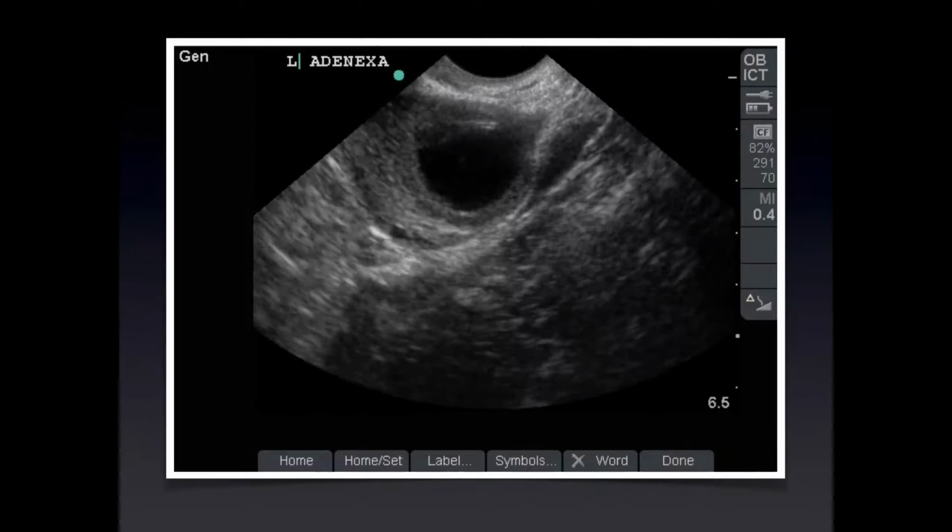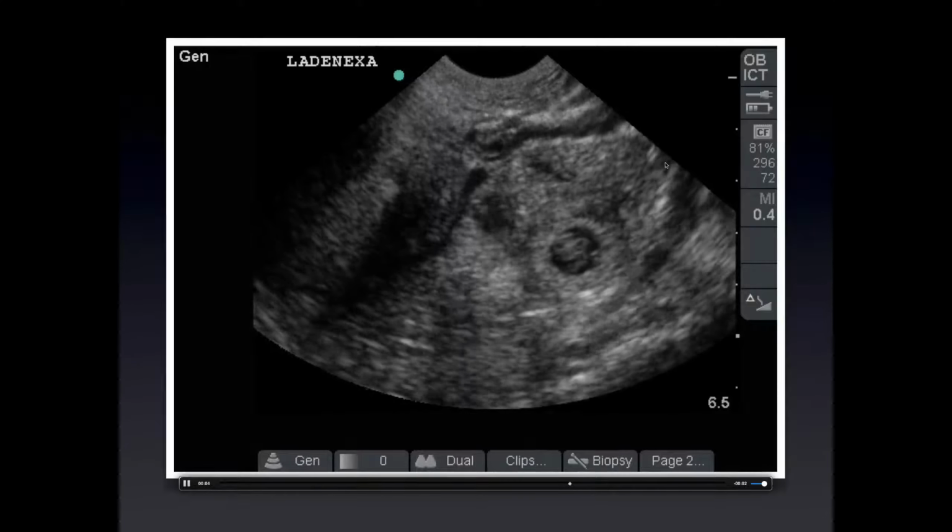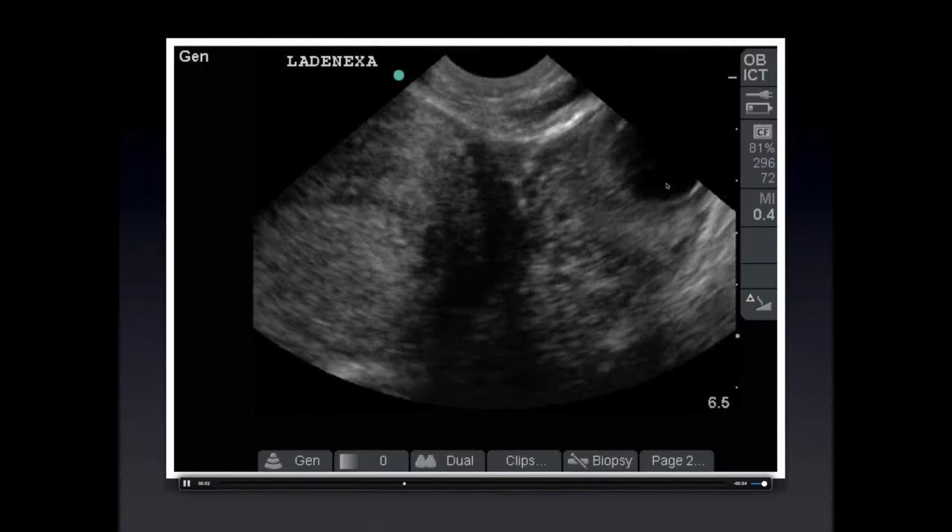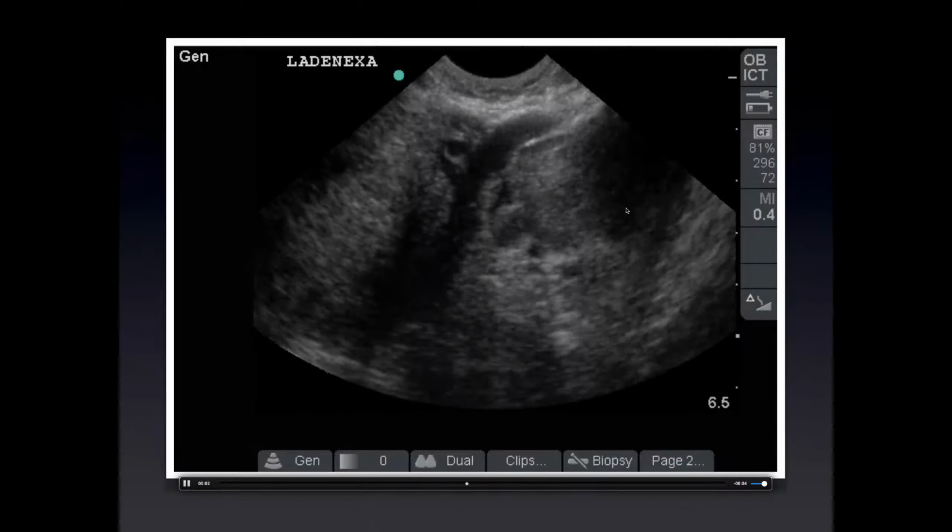Next, let's compare the tubal ring to the corpus luteum cyst in coronal plane. Here we see the ovary with corpus luteum cyst up here, and then we sweep into the ectopic pregnancy and the tubal ring. So, no bright white ring, bright white ring. So our diagnosis is ectopic pregnancy, which happens to be alive.